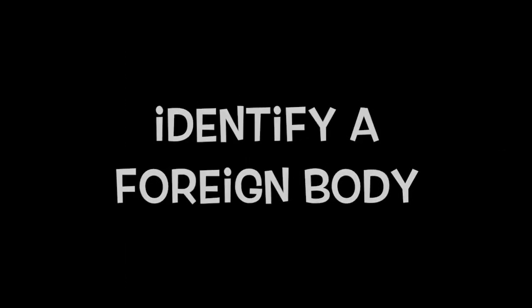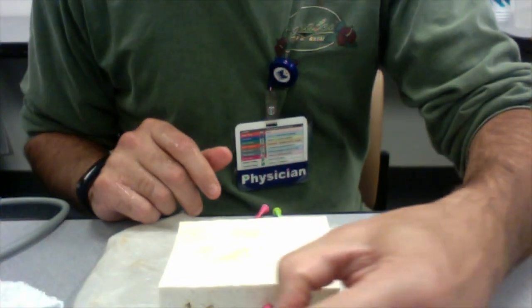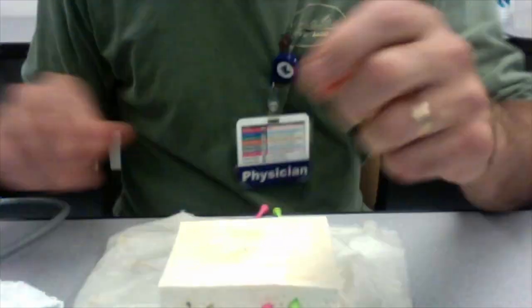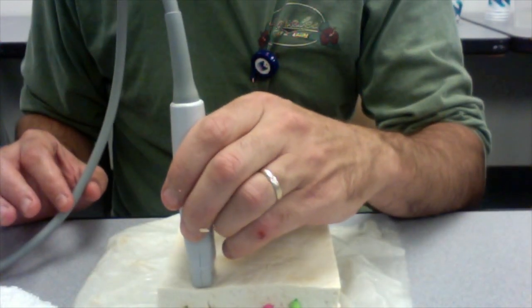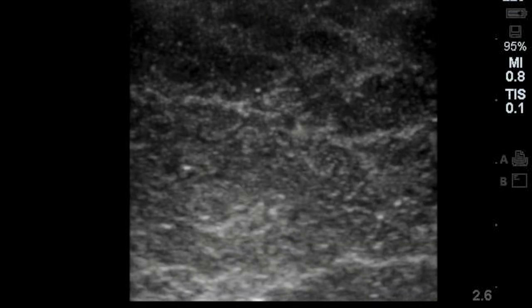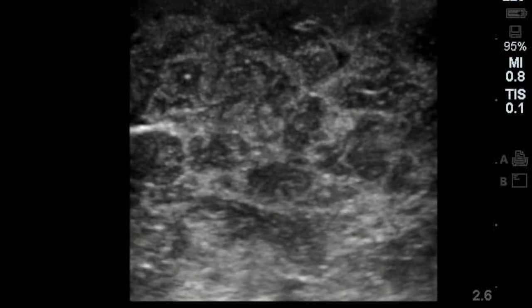Here's how we're going to identify a foreign body. Just start by getting a toothpick or any piece of plastic — you can use a paper clip — and just insert it into the side of the tofu at the depth you want, and then start to scan it. You can have students scan in transverse and then elongate, and have them try to identify what the object is as an unknown. Here we're in transverse, seeing the toothpick underneath, then switching over to a sagittal plane so we can appreciate its shape.